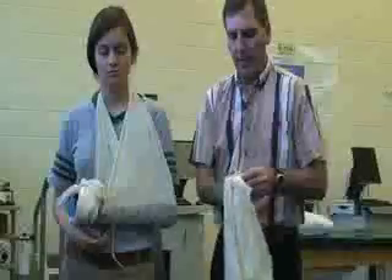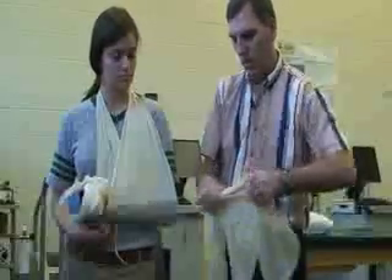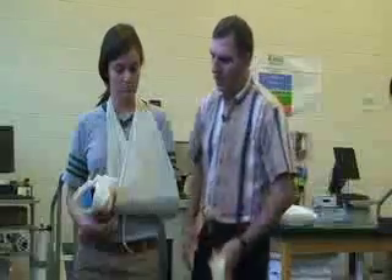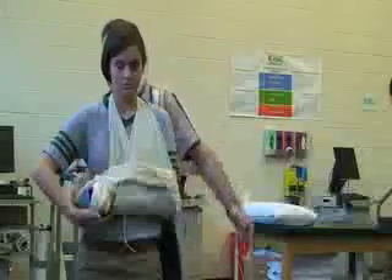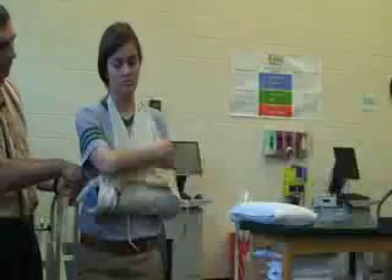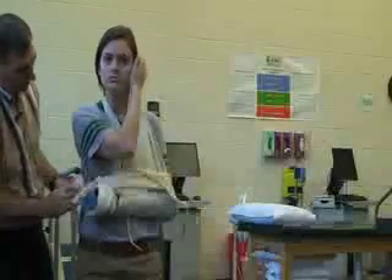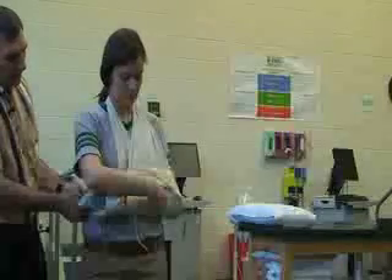With a triangular bandage, fold it or roll it. You want to be careful not to get the injured body part — this we would tie on the good side. We would put a piece of gauze underneath the knot. Make sure it's at a good height — not too far up or down on the elbow.